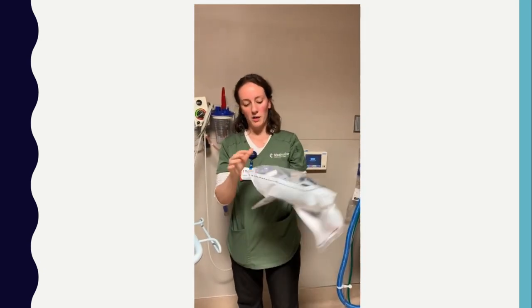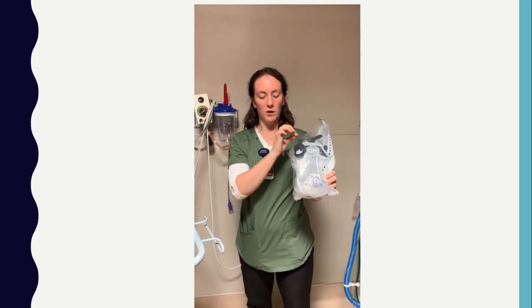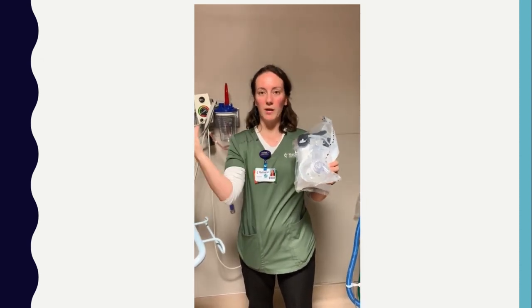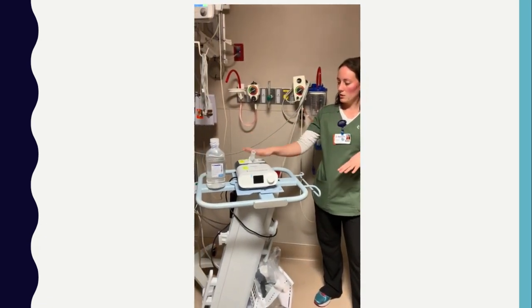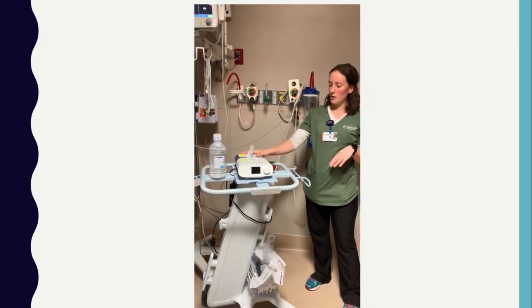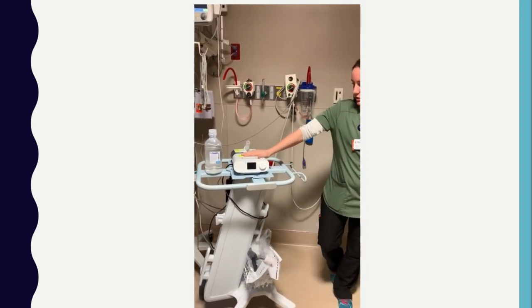And then you actually put it on them. And then they have these little clasps right here. Whenever you want to take it off, instead of having to undo all this Velcro that takes, you know, like 5 minutes, I'm sure, you just unhook the clasp and it will come right off. So it's an easy way to get it on and off the patient quickly. So that's really about all in terms of the CPAP. Those aren't too bad. They're pretty simple to use. And a lot of patients will actually come with their own CPAP machine whenever they come into the hospital. So as long as we have an order, they're good to go on using those as well.